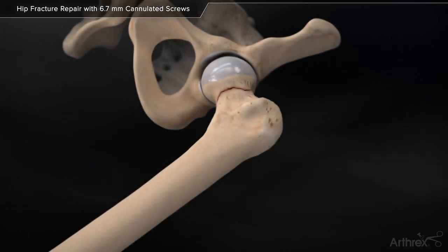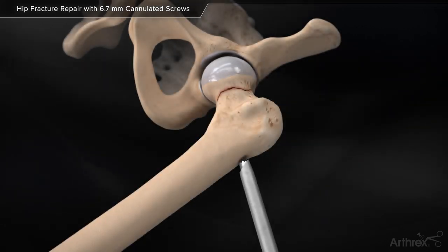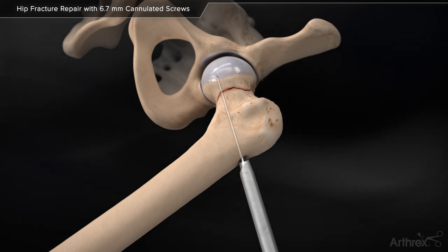Insert the 2.4mm 12-inch guide pin through the drill guide superior to the calcar, across the fracture, into the inferior femoral head.